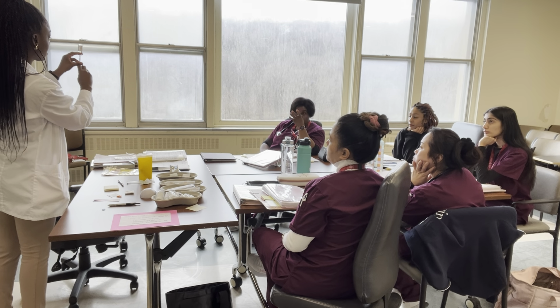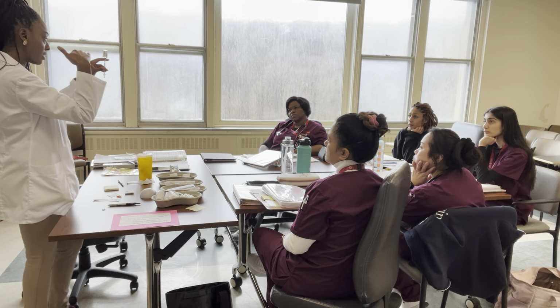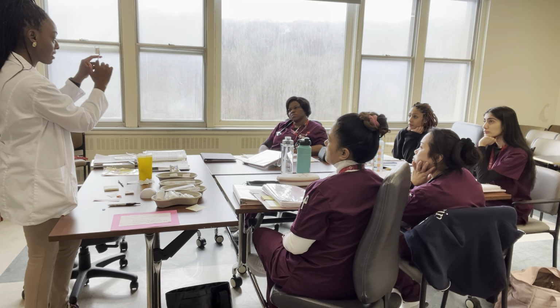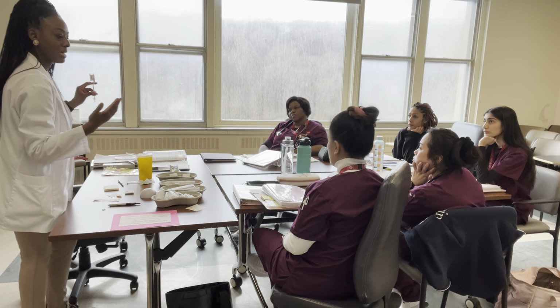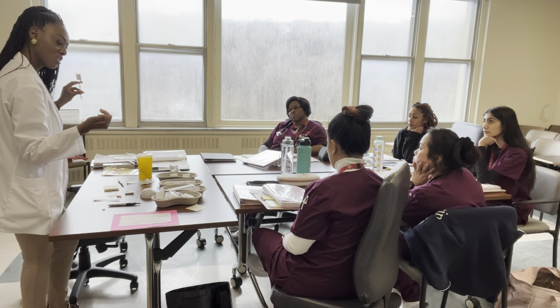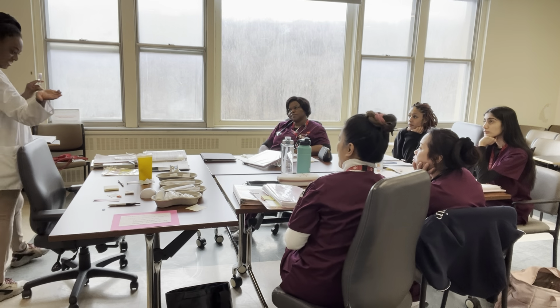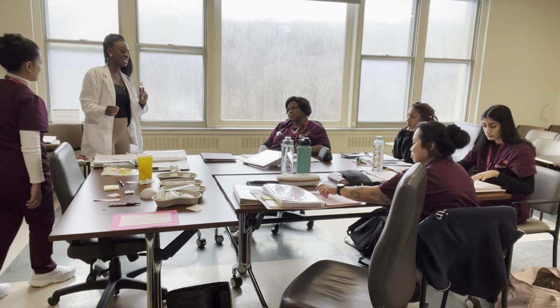And then I'll go directly to the number. I said 5 units? It's where the end of the black plunger ends at the number, okay? After that, you need to verify with somebody. So at that point, I would call Anna and say, Anna, please, can you come and verify the insulin with me? And she would come, because it's always an independent verification.